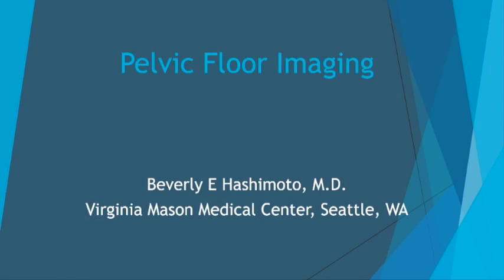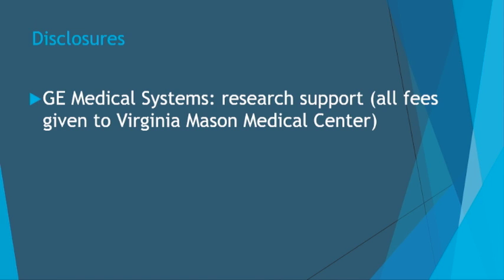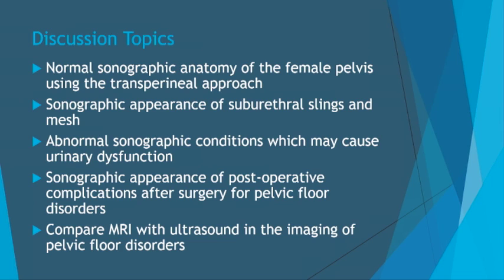Well, I'm going to be speaking about pelvic floor imaging. My disclosure is that I have received support in research from GE Medical Systems.